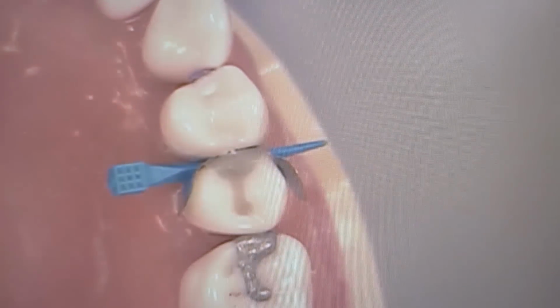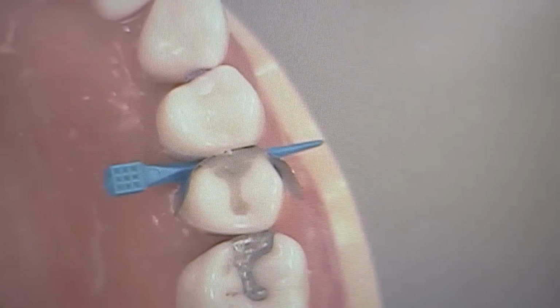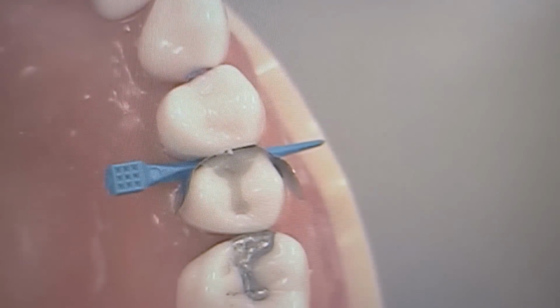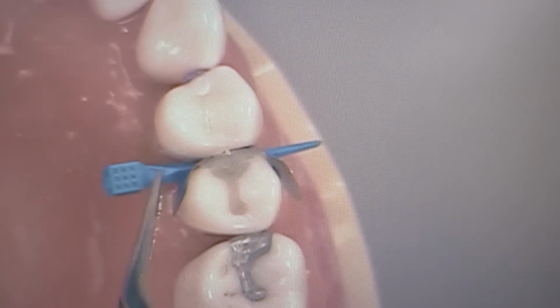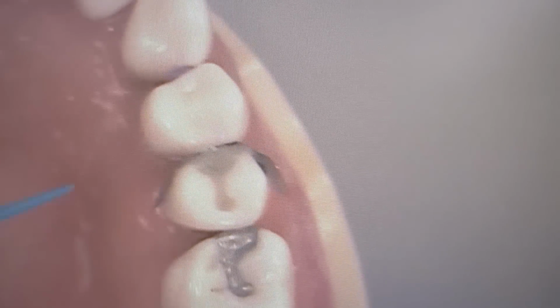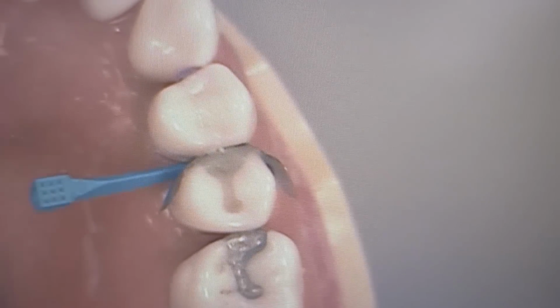Then you do the important parts. Actually, before we get started, this wedge needs to be put in until it's resistant. If you over wedge it, your final restoration is not going to be good. So only push in the wedge until it meets resistance. Don't over wedge it. So this is a little bit too tight. So just wedge it, don't wedge too much. So this is pretty loose. Otherwise you'll be over contoured.